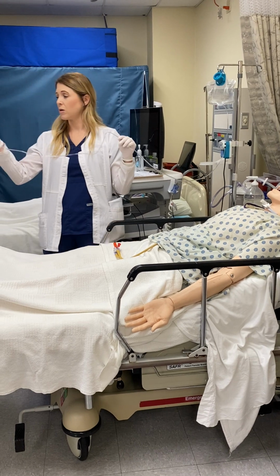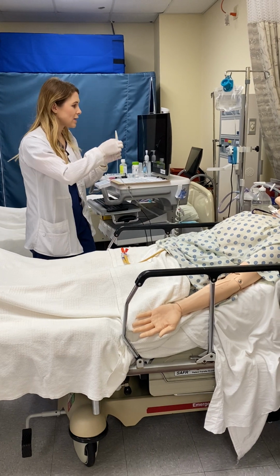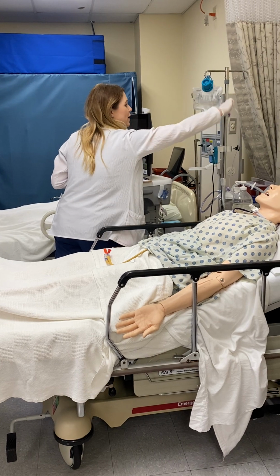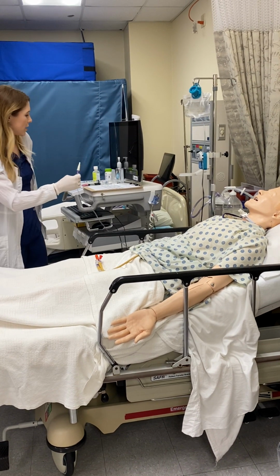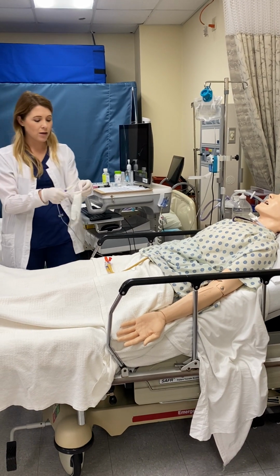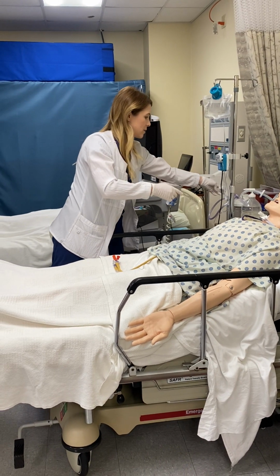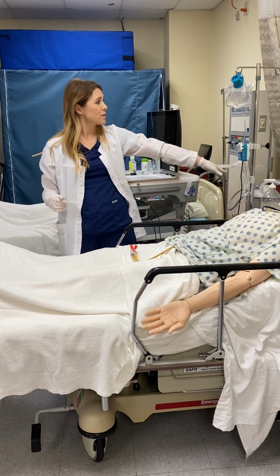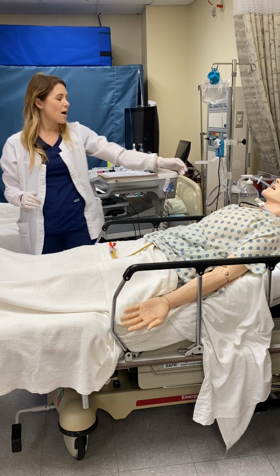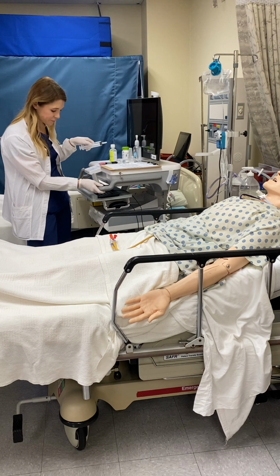Again, consider this like a fork or a spoon. We don't want to drag it on the floor in their peri area. I typically have the cap taped onto here so I can just stick it in there or something of that nature. If not, and you want to make sure you keep it clean, you could use a clean glove or however you want to make sure it's not going to fall on the floor and get contaminated, okay? It is going to alarm. I think this one only pauses for 2 minutes, which is fine. I could shut it off completely, but for now I'll just leave it that way.